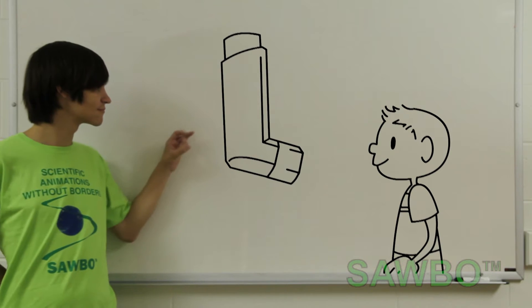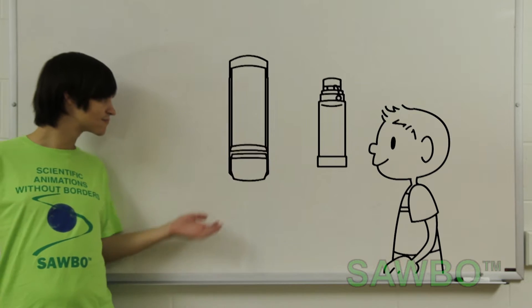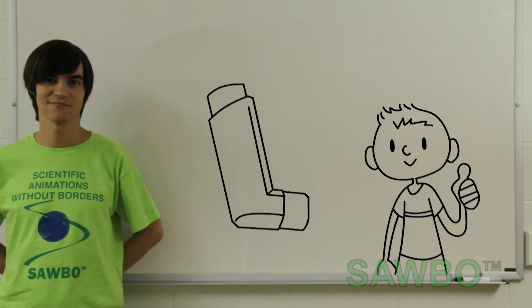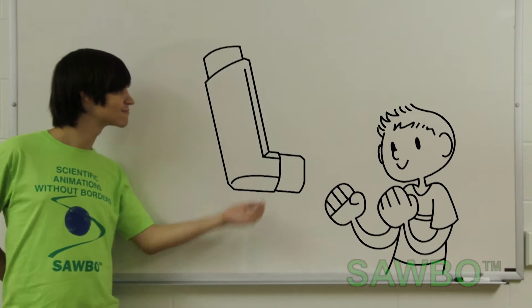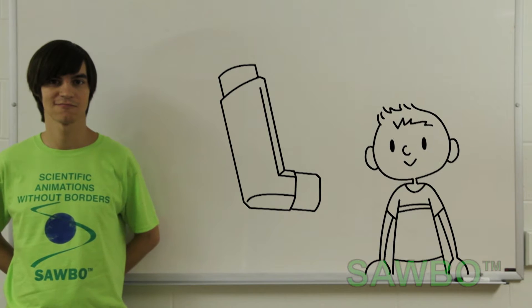Let's take the cap off now. Check if both the inhaler and spacer are clean. First, shake your inhaler. You must make sure to shake it very well. Now you are ready to start using your inhaler.